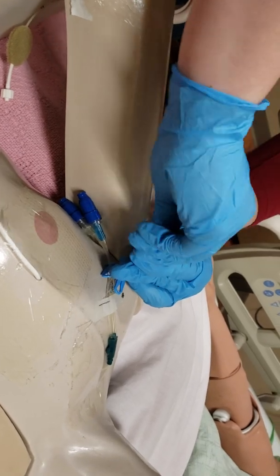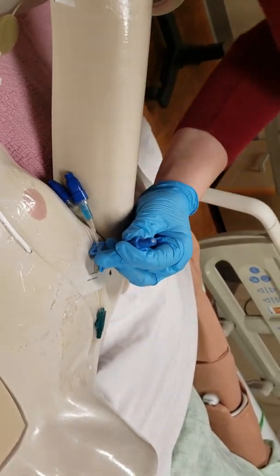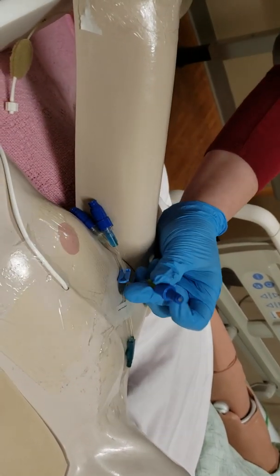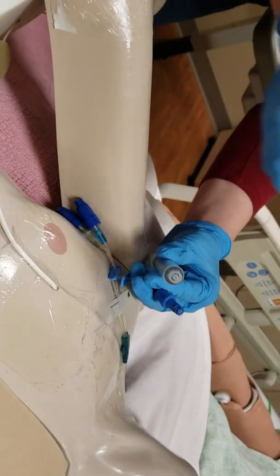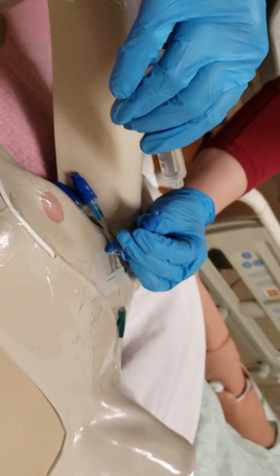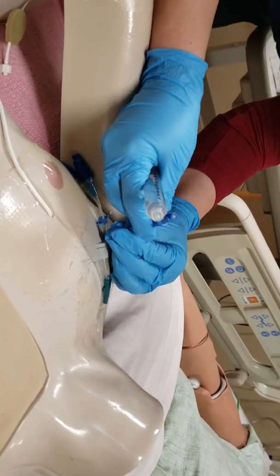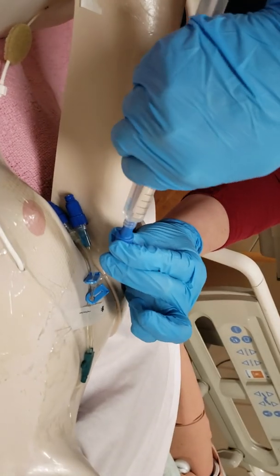Five minutes after I administer this drug, I want to assess respiration and heart rate. And then at the hour mark, I should come back and reassess her pain level and make sure that it has taken effect. Okay, so I've unclamped.